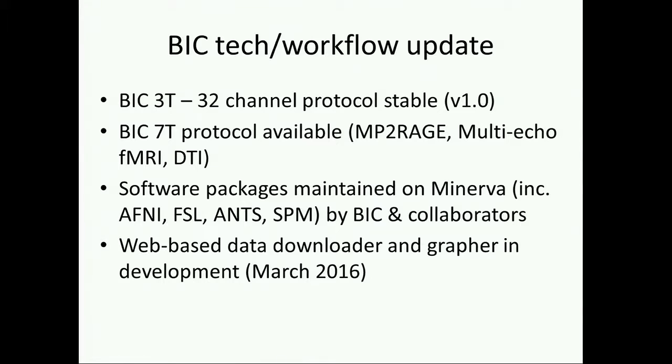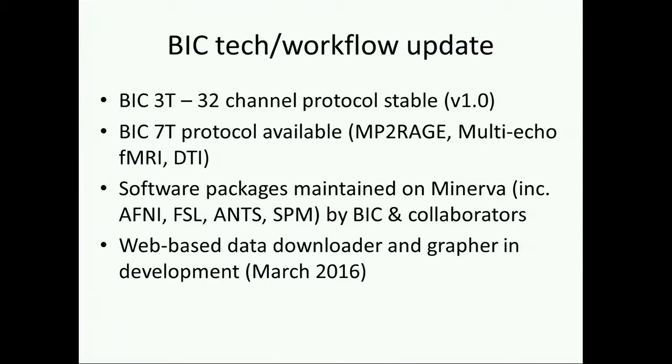That process is led by Rafa Hulleran with some help from myself, using MP2RAGE, which we're not going to talk about at length, but it's an anatomical sequence that gets you T1 mapping as well as control for a lot of the intensity artifacts that you see at 7T. We also have multi-echo fMRI, which helps significantly reduce the artifacts and distortion seen in 7T fMRI, and we also have DTI using the HCP sequence.